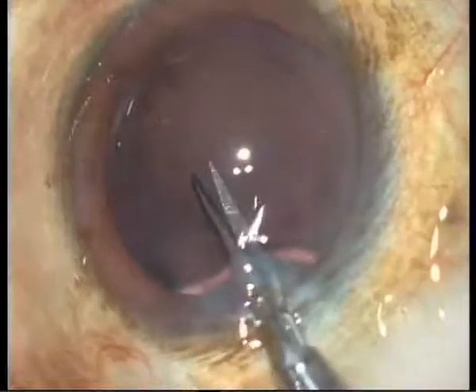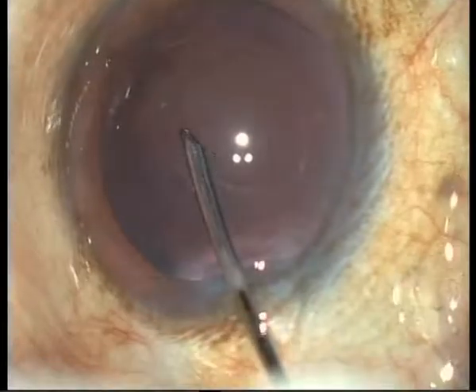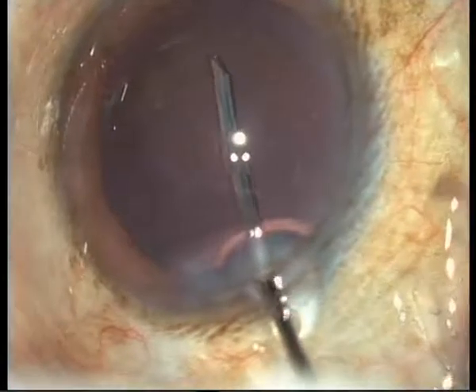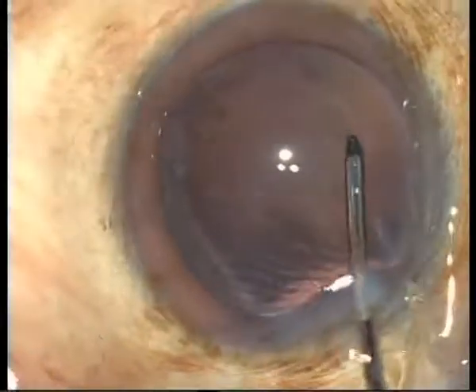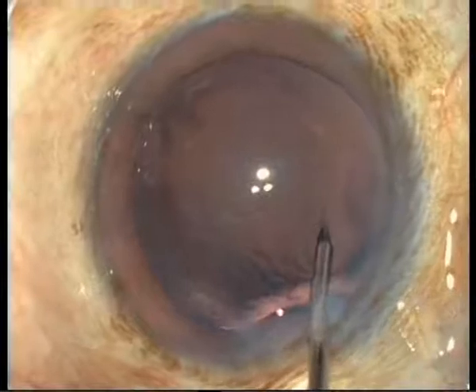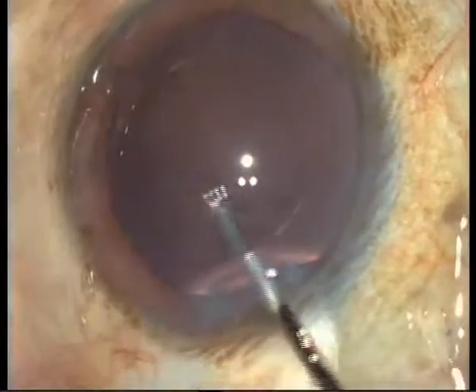I need to redo the opening a little bit because this is a very thin posterior capsule. She created a nice flap cut in the initial opening and will now be able to generate a flap again. What happened is that when trying to make the rhexis, the margin didn't form to the right size, so she made a new discontinuity in the original opening and went the other way to complete and encompass that original opening. Very nicely and beautifully done — look at the control she has, absolutely beautiful.